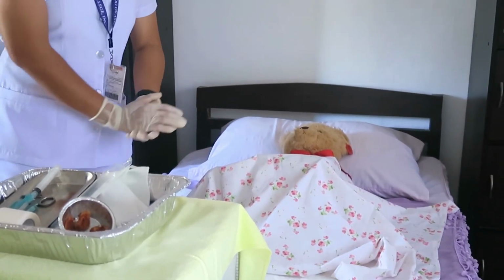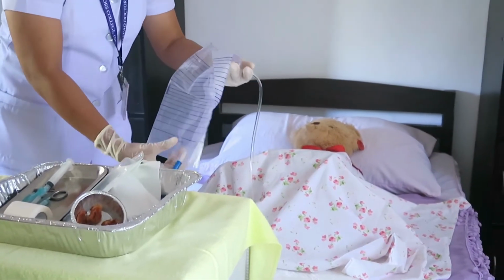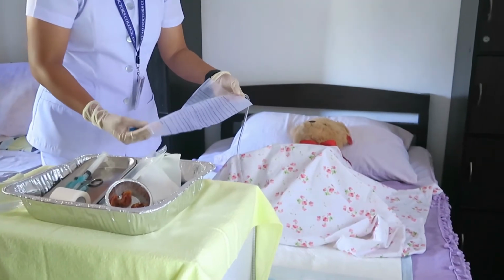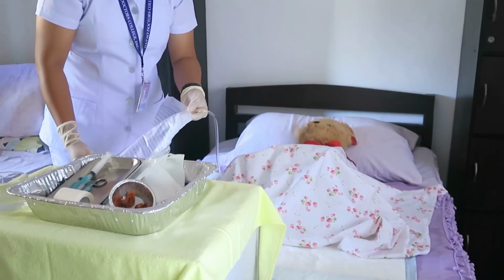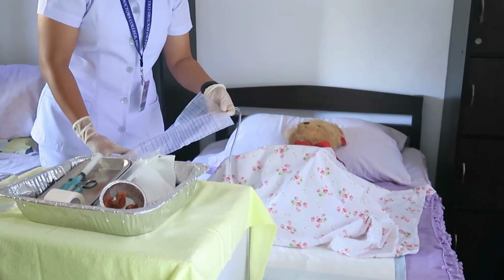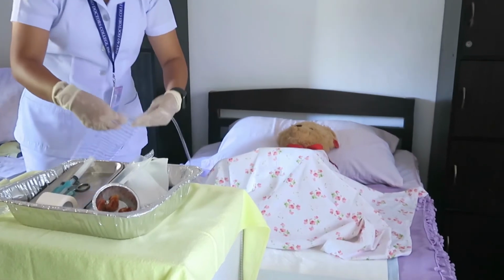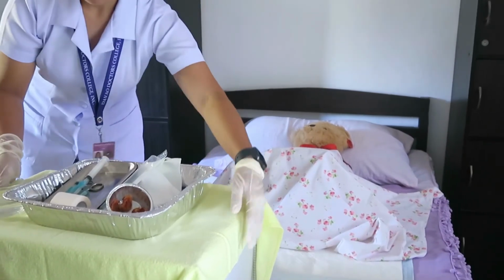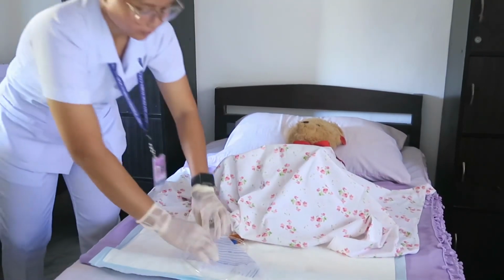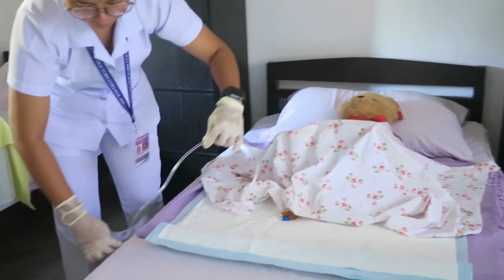Remember, secure the drainage bag, which is, this is the drainage bag, or the urine bag below the level of the bladder. Check that drainage tubing is not kinky and that movement of side rails does not interfere with catheter or drainage bag. So, I will move it. Remember, this is the urine bag. Then put it there.